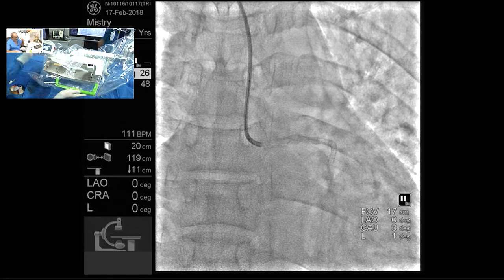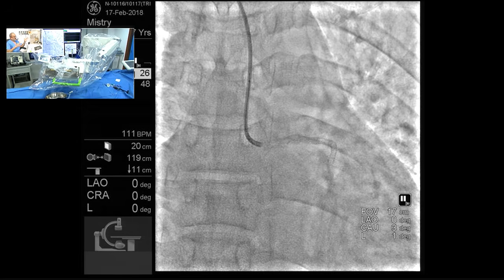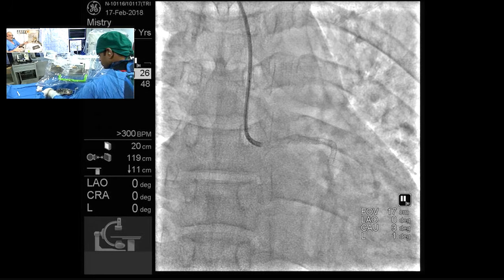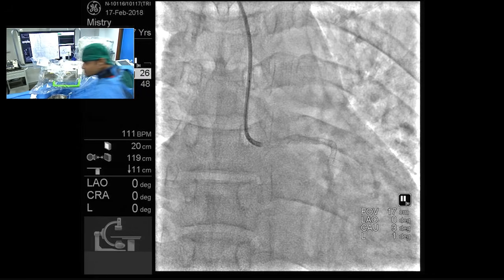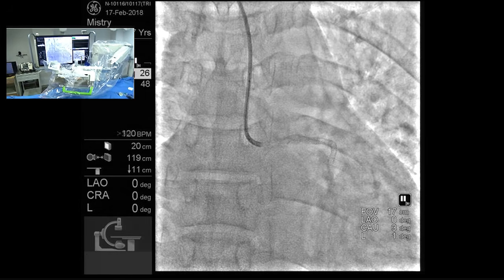Any new technology or technique which I have adopted in my career, when I start something new, myself and Sanjay, we make it very clear that we are students and we will do it step by step. If there are 10 steps of any procedure, I will not skip any one, despite my experience of nearly 100,000 cath lab procedures.